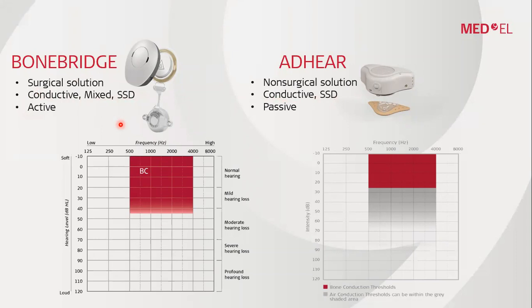The BONEBRIDGE is an active solution, and we are going to talk in much more detail later about the difference between active and passive. But simply, active means that the part which is implanted under the skin is the part that vibrates. So it gives a direct vibration to the skull of the patient without the losses from the skin, while the ADHEAR is a passive solution, because it is a non-surgical solution. The BONEBRIDGE has an age limit of 5 years or older, while ADHEAR has no age limit, so very young babies can still benefit from the ADHEAR.